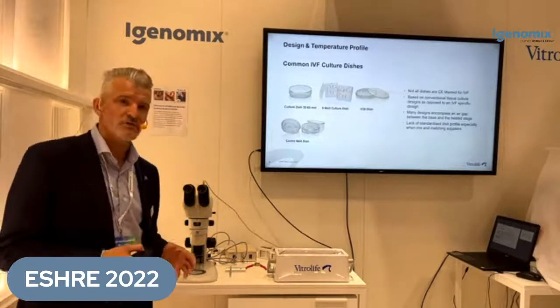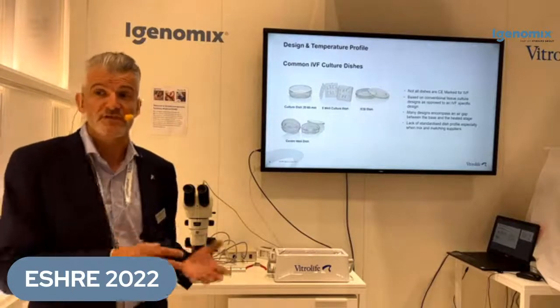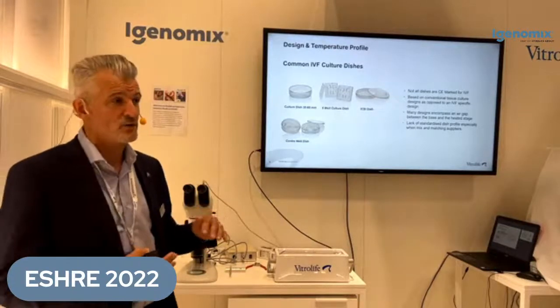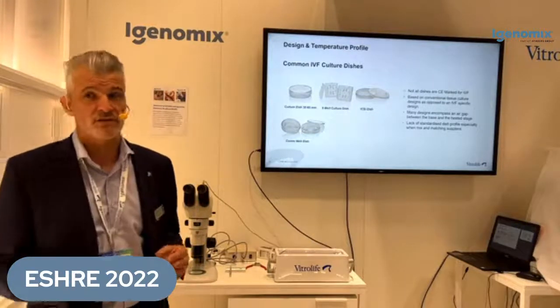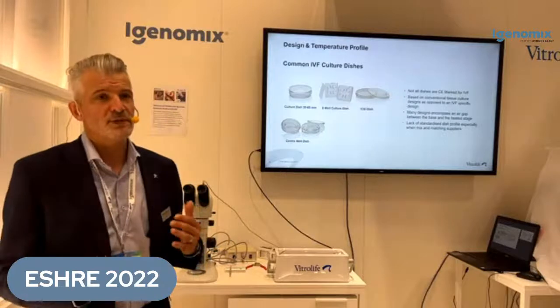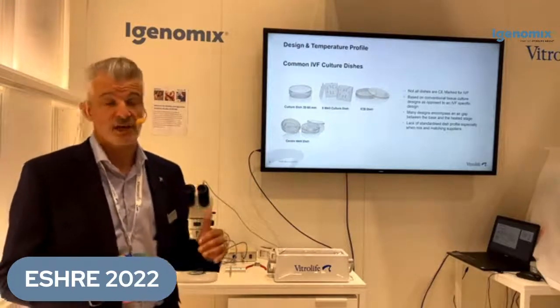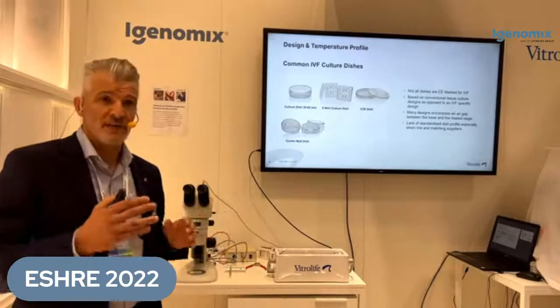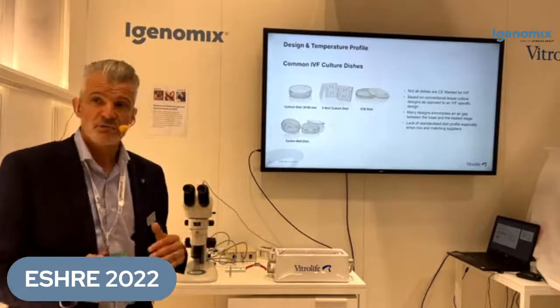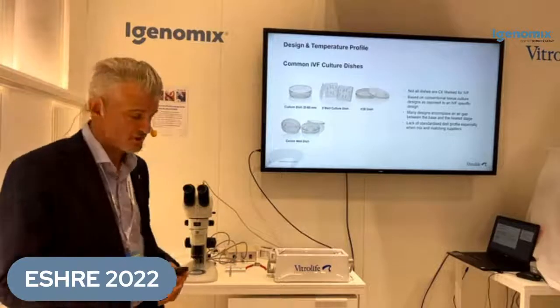If we think about traditional IVF plasticware, many of these dishes were designed rather for tissue culture applications. They were never designed specifically for IVF use. This means they have a design which is not the ideal that we would require. Many traditional plastics used in an IVF lab would have an air gap between the base of the culture dish and the heated surface. This means that laboratories need to adjust the set points on their heated stages to accommodate for this air gap to achieve a consistent temperature in the dish. Where you start to mix and match from many different suppliers, these plastics will all have a different profile and different thermodynamics, which means if you've calibrated your stage for one dish, it's not necessarily going to be the same temperature in another manufacturer's dish type.